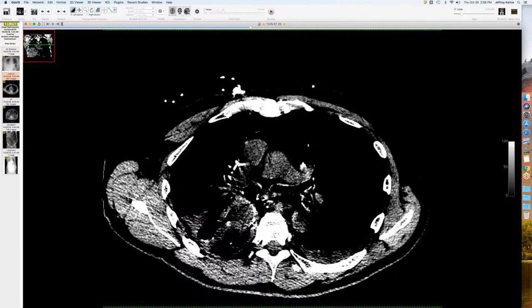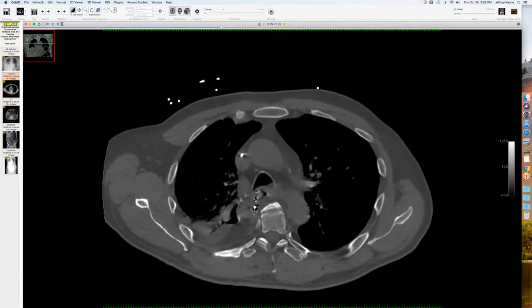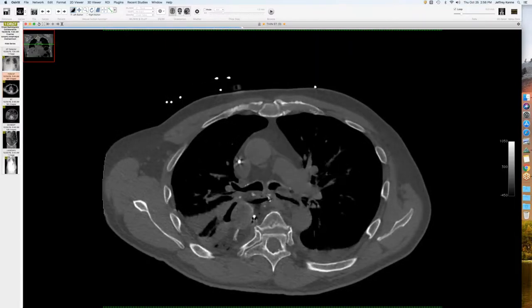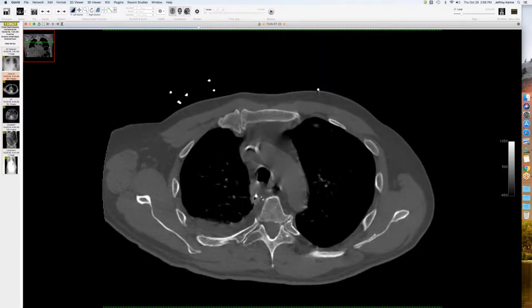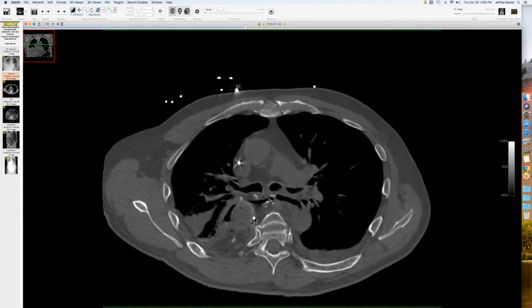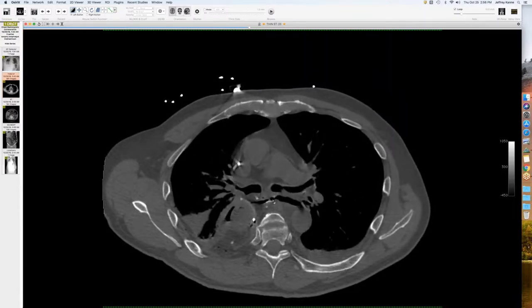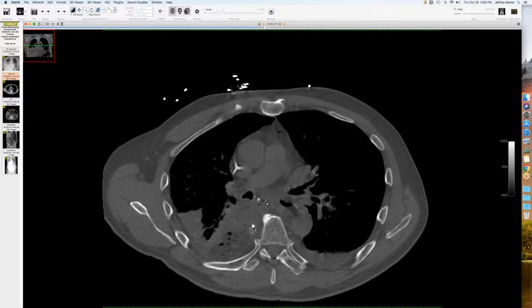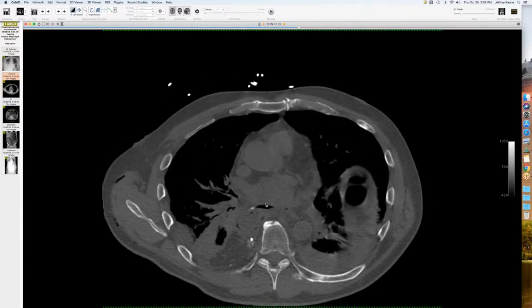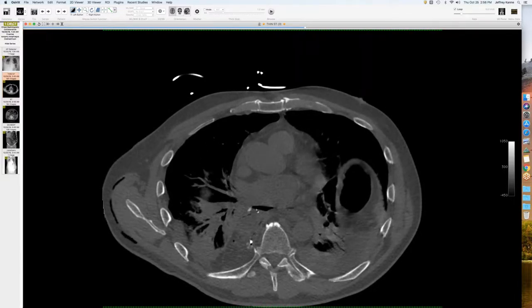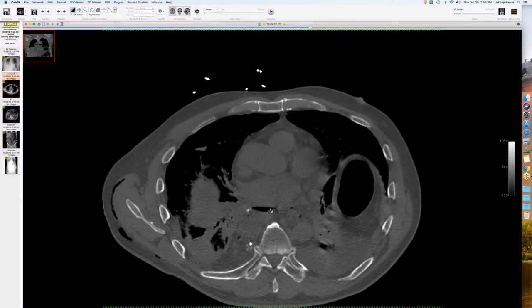Kudos to my resident who did not fall victim to satisfaction of search in the middle of the night and also evaluated the chest. You can see this is an end-to-side anastomosis, and notice there was also pneumatosis in the conduit — this is stomach. Also the resident observed gas tracking laterally in the mediastinum where it ought not to be, about a week out. This is not just bubbles in the mediastinum — this is a space filling with gas right around the staple line. The resident identified this as a probable dehiscence of the staple line with a leak, which I 100% agree with. There's also another collection anteriorly, which I suspect is a leak as well.